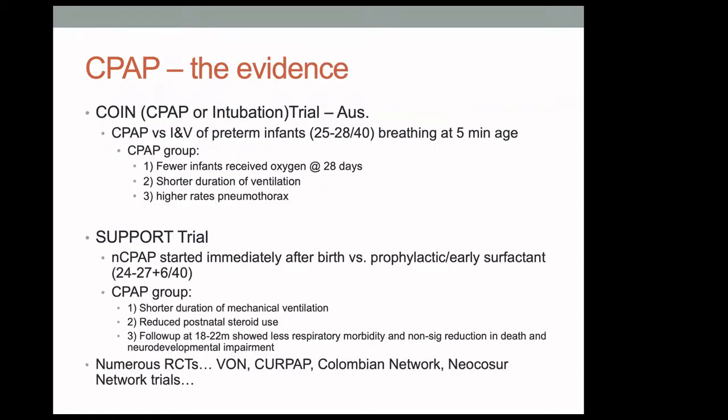So there have been numerous randomized controlled trials and lots of evidence on the use of CPAP, including the COIN and SUPPORT trials, randomized controlled trials from the Vermont-Oxford network. But I've got two here that I'll just go through briefly.